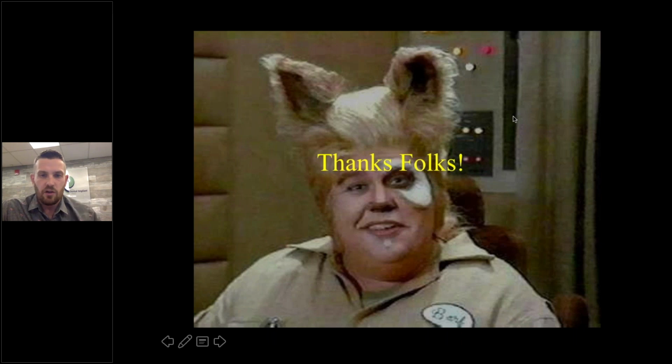Okay, so next question from Randy. Can you go over the pilot hole for a tack, instrument to hold the graft? Typically what I've found, you could use cotton pliers if you're ballsy enough, they do work, but really I have a specific membrane tacking device that I use. I got that from the Meisinger kit, and it has a pointy end on it, and I will use that to poke a hole into the membrane at the corners. I typically leave about 2.5 to 3 millimeters of space between the pilot hole and the external aspect of the membrane to avoid any type of fracture of the actual membrane.